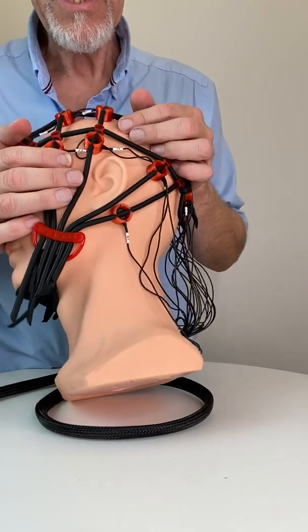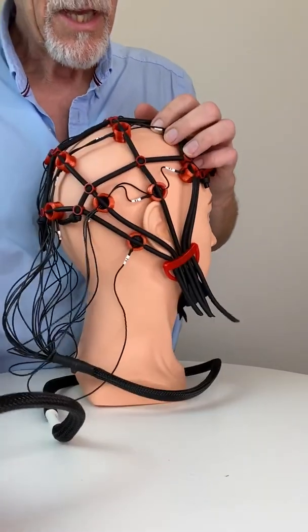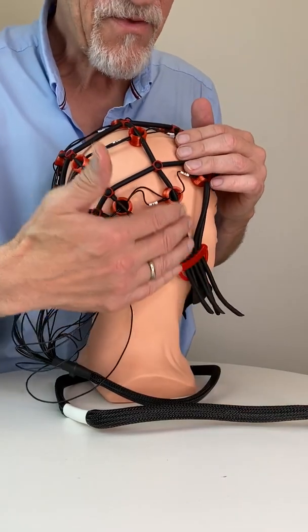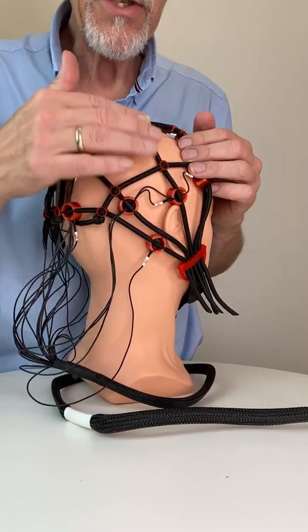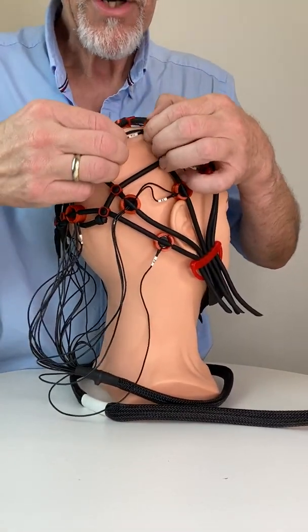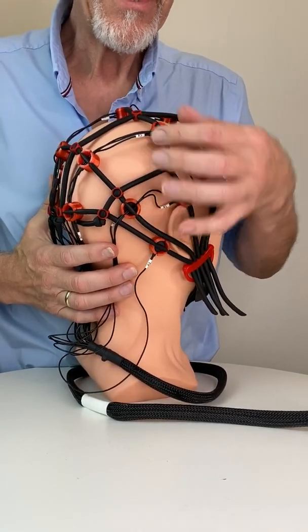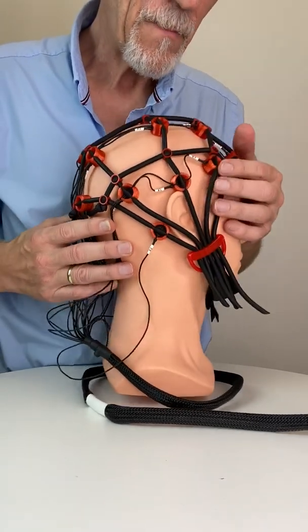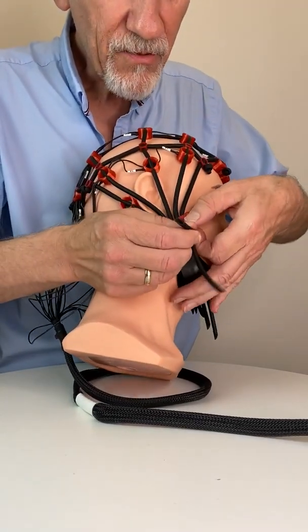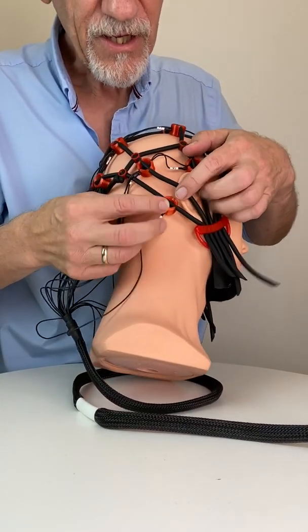Here is my T3, and on the other side the same. Correct it so you have a nice straight line from here to Cz. You see this is not really straight — I can correct it. Pull it a little bit here, put it in the right position. Here we have a loose tube again — pull it down, getting enough pressure. This is good.